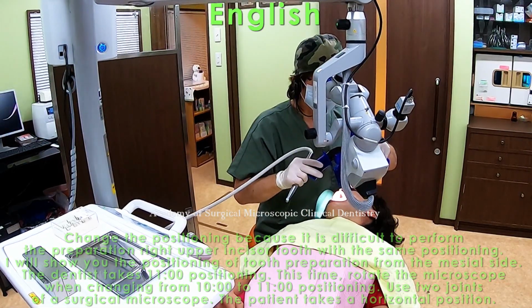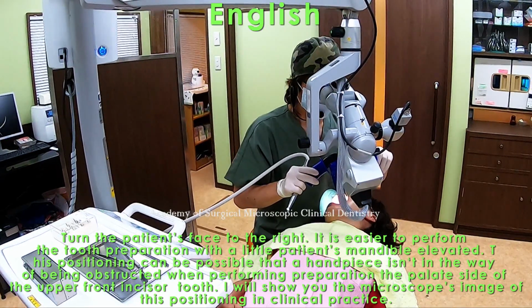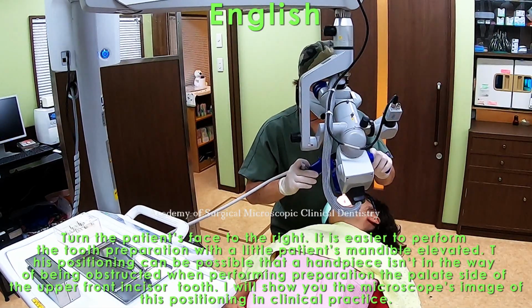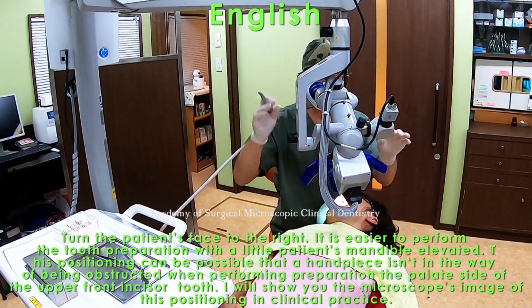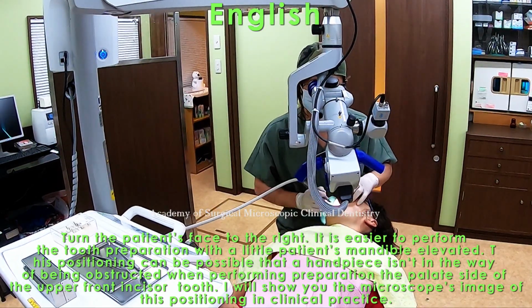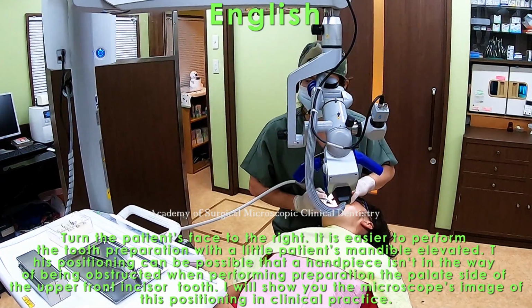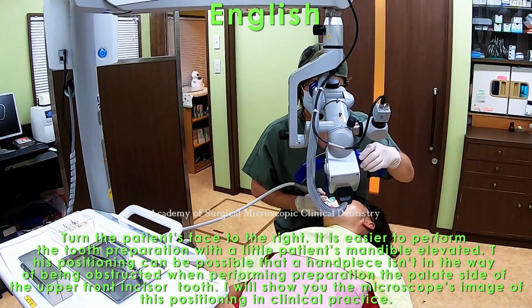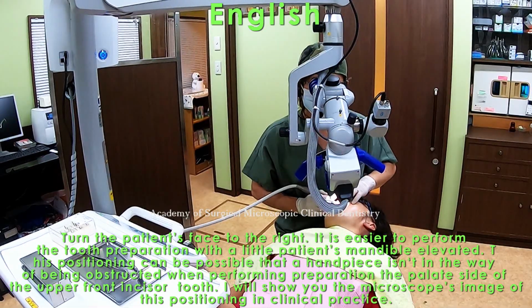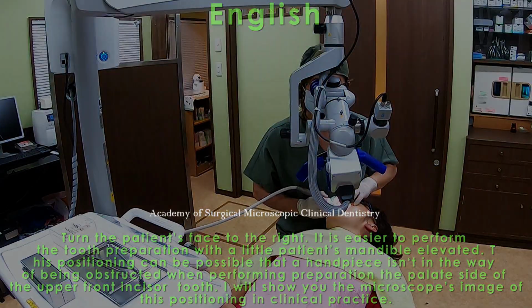The patient takes a horizontal position. Turn the patient face to the right. It is easier to perform the tooth preparation with the patient's mandible a little elevated. This positioning makes it possible that the handpiece isn't in the way or obstructed when performing preparation of the palatal side of the upper front incisor tooth. I will show you the microscope's image of this positioning in clinical practice.